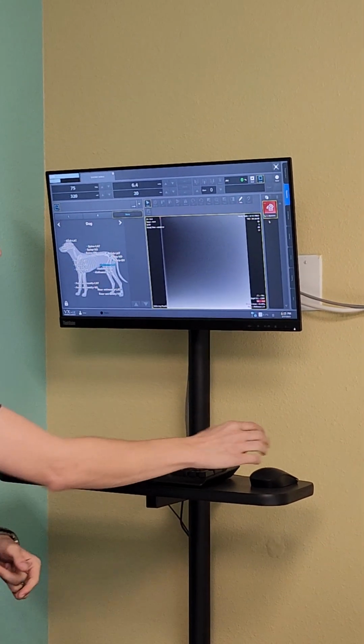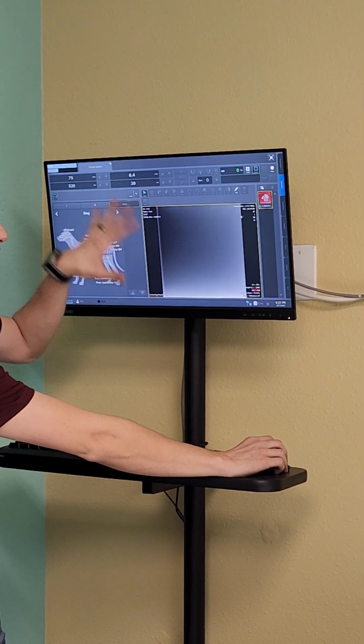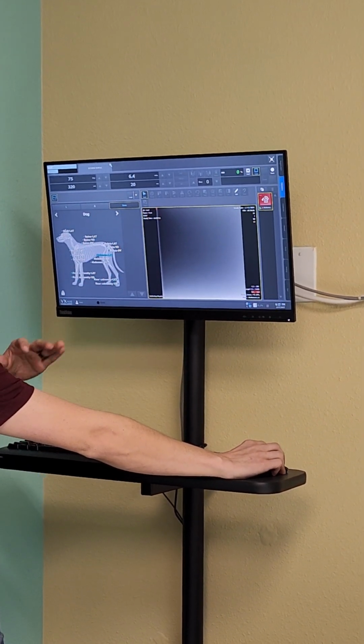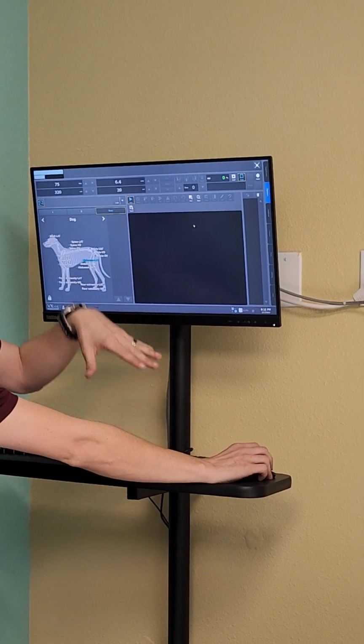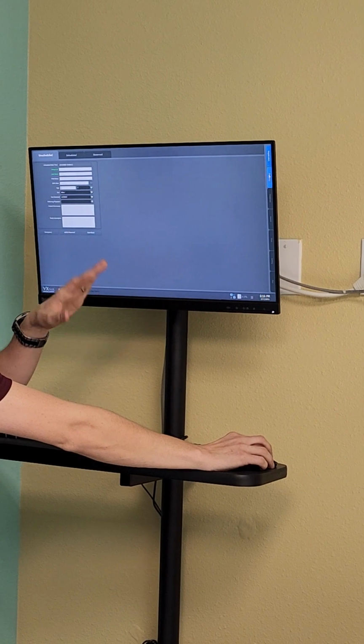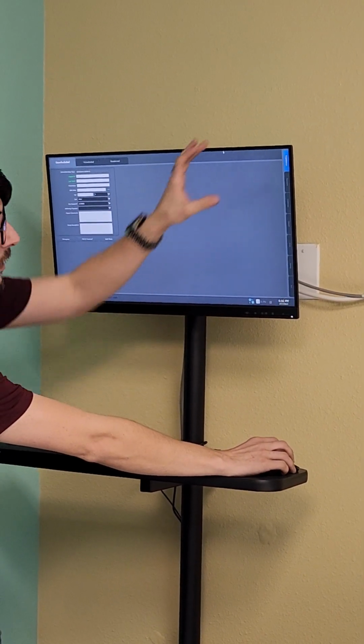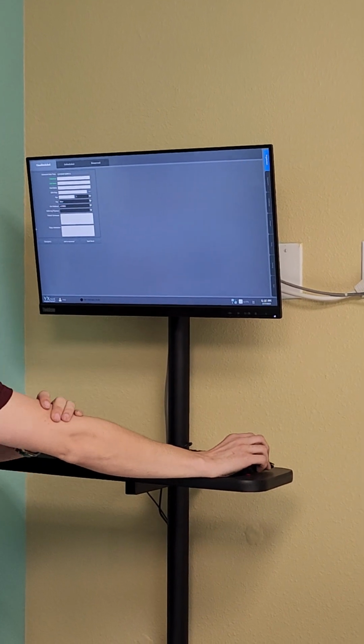From there, this is your exposure tab. Everything is pretty much done with exposures in the exposure tab. So once you close out of that, it should bring you back to registration, but for some reason it didn't. But you're going to navigate all these tabs over here.